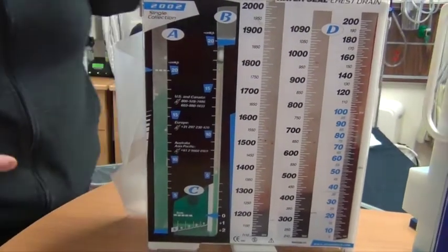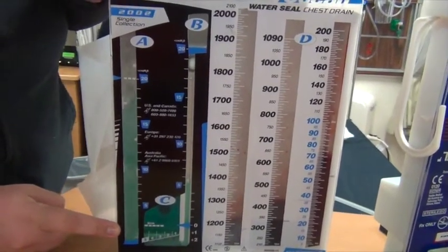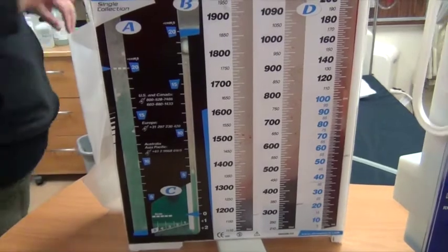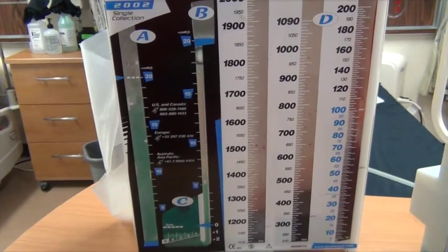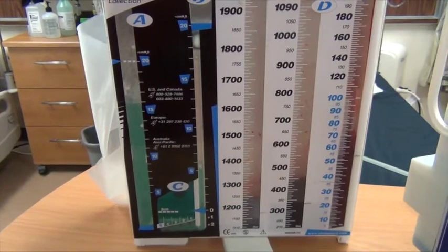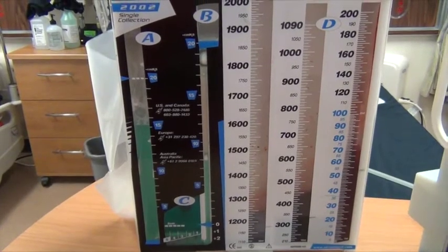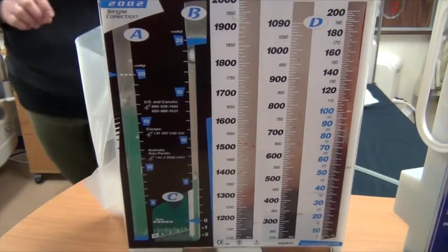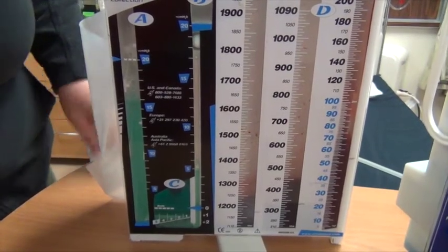Now, we don't want this bubbling so rapidly that it sounds like a fish tank in the patient's room. This is way too high. It's bubbling like crazy. It's going to evaporate. We want a slow, intermittent, gentle bubbling. So I'm simply turning down the suction. And that's still a little too fast.